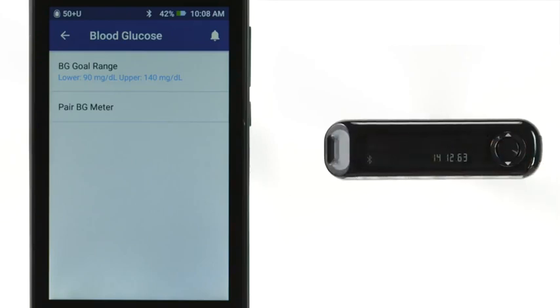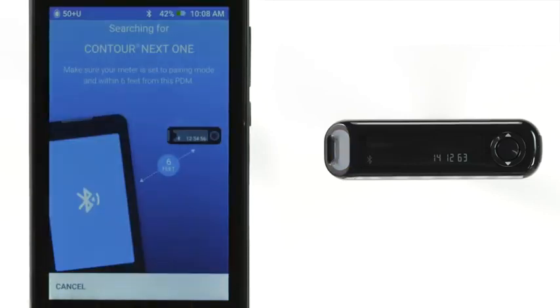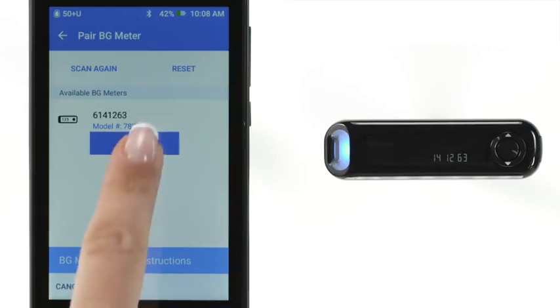The meter is now in pairing mode. From the PDM's Blood Glucose menu, tap Pair BG Meter. After the BG Meter is found, verify that the serial number shown in the bottom right of the BG Meter matches the number displayed on the PDM. On the PDM, tap the button that says Pair beneath the BG Meter's serial number.